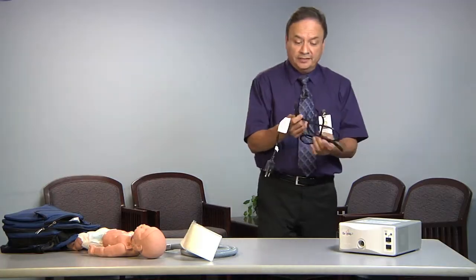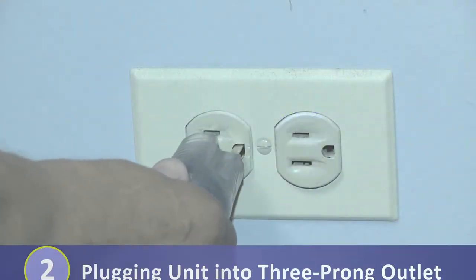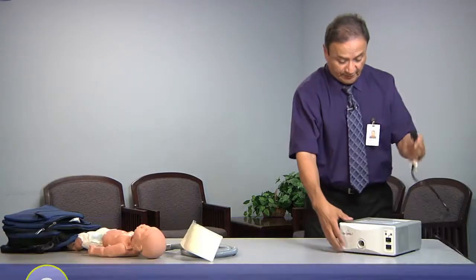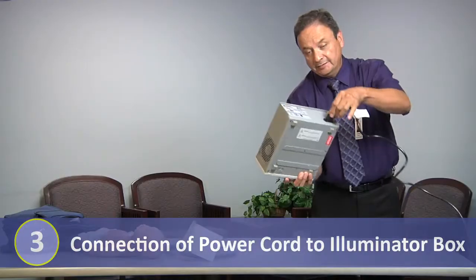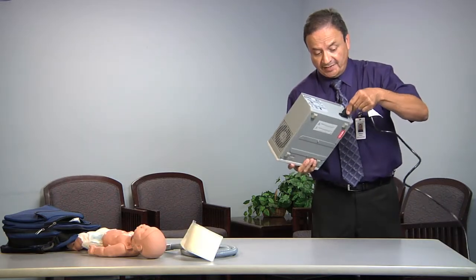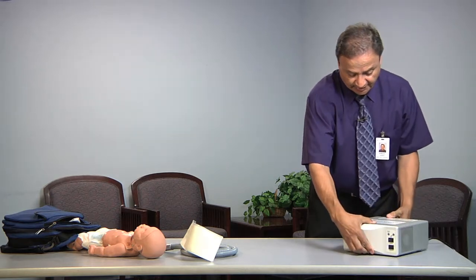It's very important that when we plug this in, we don't use an extension cord. It is a 3-prong. The other end will match up with the back of the machine, and plugs in real good right in here. If the machine doesn't ever start up, always check back here because sometimes this can slide out. And we got it set up.